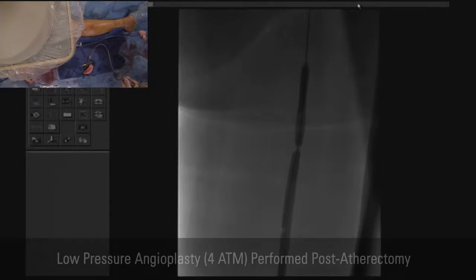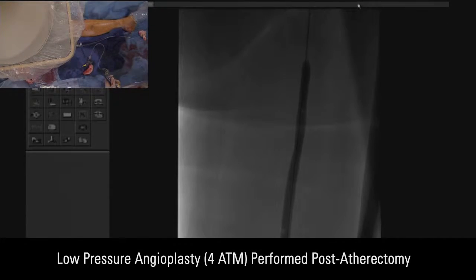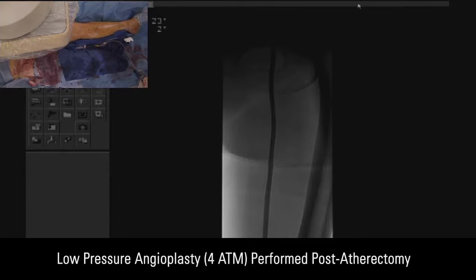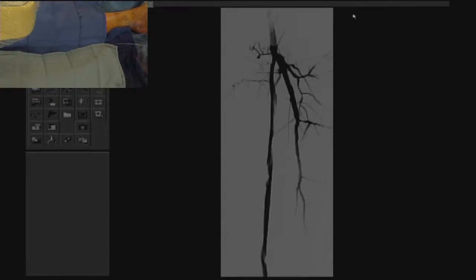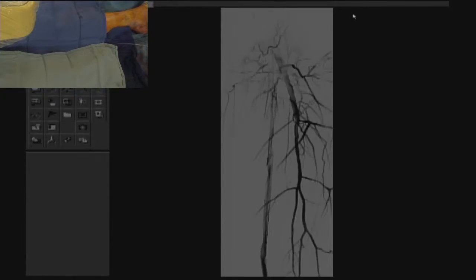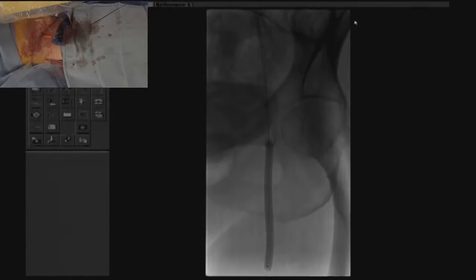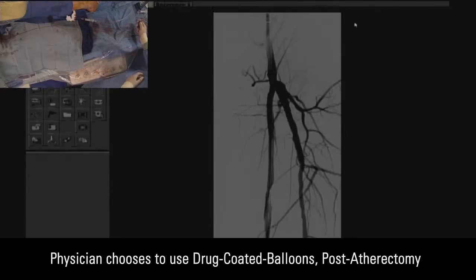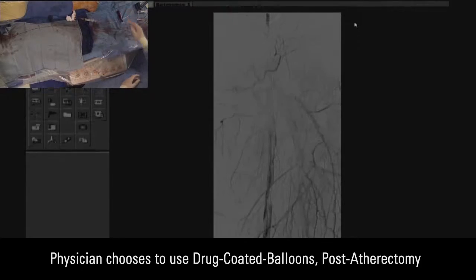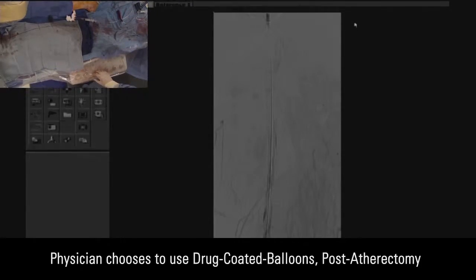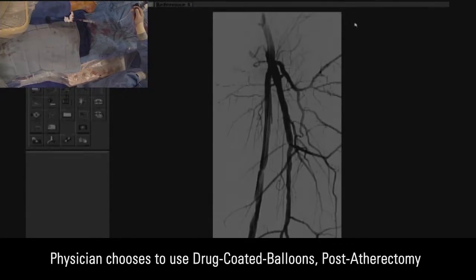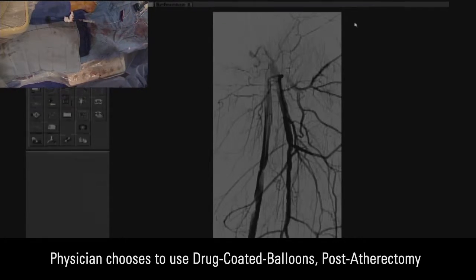We're using a long 5.0 by 300 Ultraverse balloon, inflated at four atmospheres. Looking at the angiographic pictures, we see a type B dissection, not necessarily flow limiting. After performing sequential balloon angioplasty with the drug-coated balloon, this was the final angiographic result — a type B dissection, not necessarily concerning, not flow limiting, with no significant gradient across the lesion.